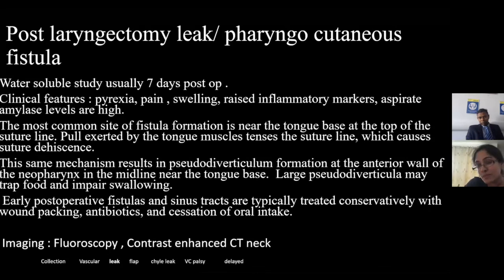Usually it used to be, you can correct me if I'm wrong, that you would do a water-soluble swallow at 7 days to see if the anastomosis held. Now, clinical features, again, I'm not going to teach you how to assess patients clinically, but let me go to the picture.